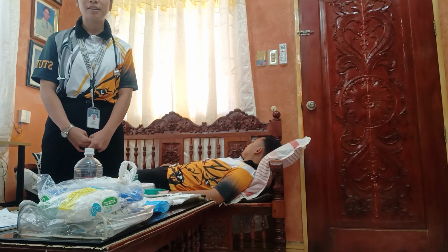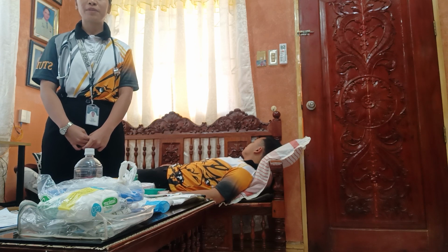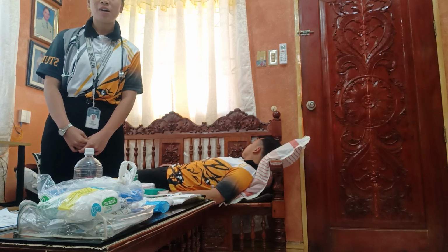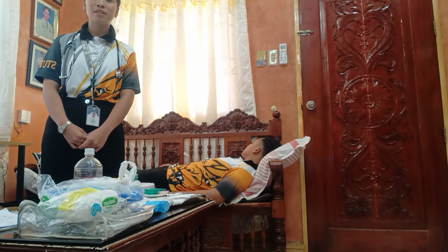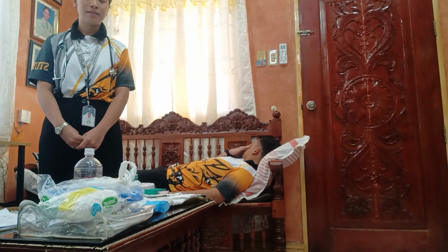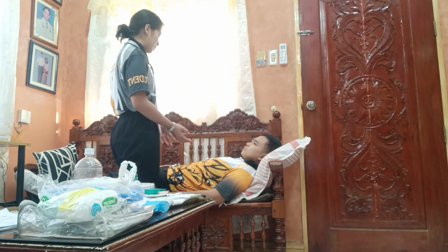If the patient is unable to maintain the upright position, drape the chest with a bath towel or disposable pad and have the emesis basin and tissues handy. Okay, sir. Yan po. Please put it in the same Fowler position po.